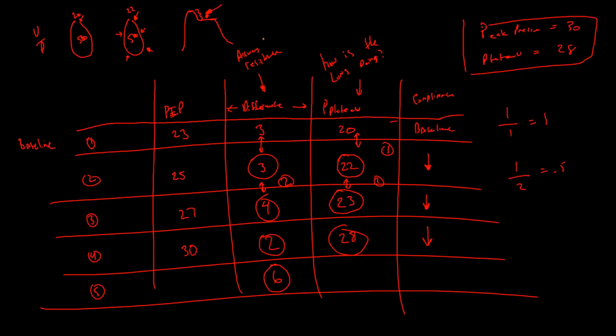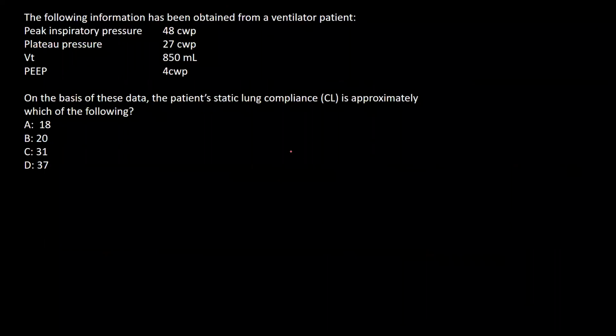Well, you can't always go by that. Let me go to a blank page here. Oh, we don't want to do that, that's what we're doing next time. Okay. If you have a peak pressure or breath that's like that, and one that's like that, this has higher airway resistance, because this is where you're getting your values. Let's say this is 30 and this is 26. And let's say this stays at 26. Well, this is probably like 28 for peak inspiratory pressure.